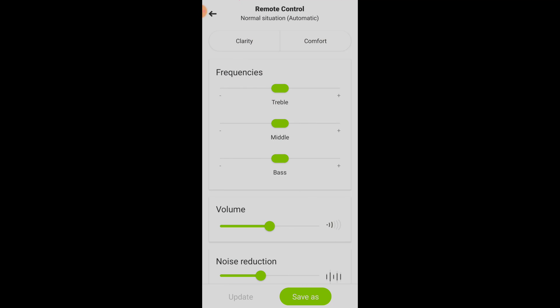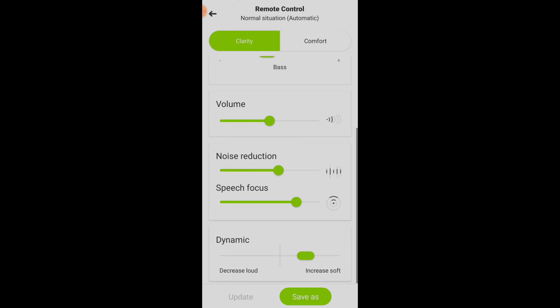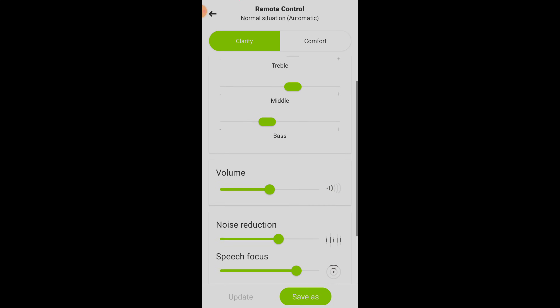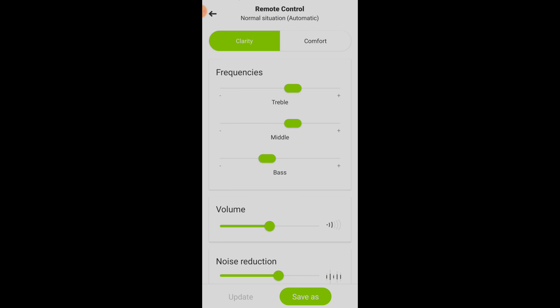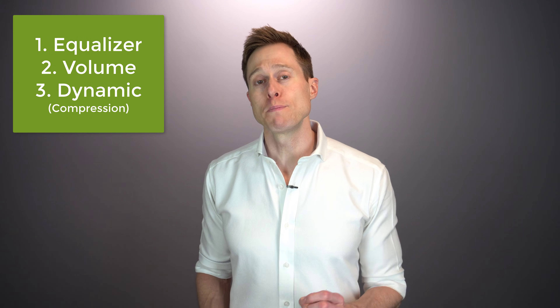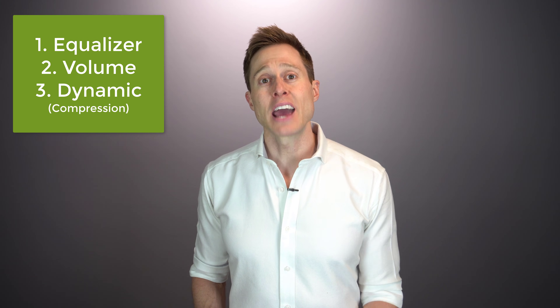Let's take a look at customizations you could make inside the My Phonak App Advanced Features section to help you hear someone who is a soft talker better. Hearing soft-spoken individuals is something that nearly everyone with hearing loss struggles with, especially since everyone started wearing face masks at the beginning of the pandemic. The first thing I would recommend is using the Clarity Quick Key, which automatically adjusts multiple parameters that Phonak researchers have identified to increase audibility and clarity of a soft talker. To get even more benefit, I would recommend changing three parameters: the three-band equalizer, overall volume, and dynamic compression settings.